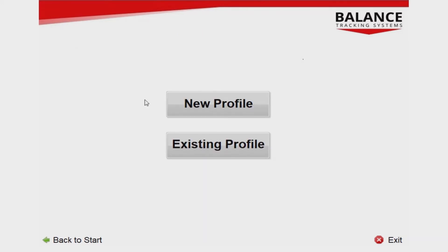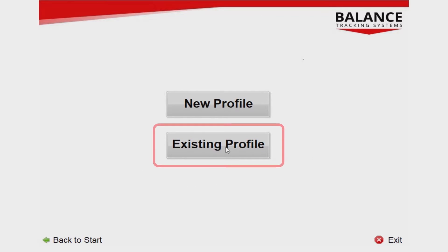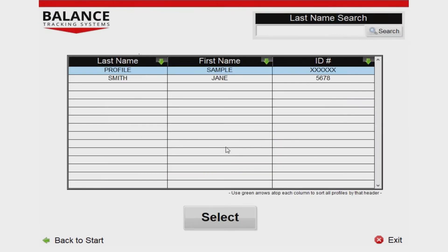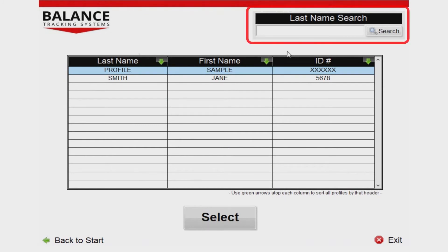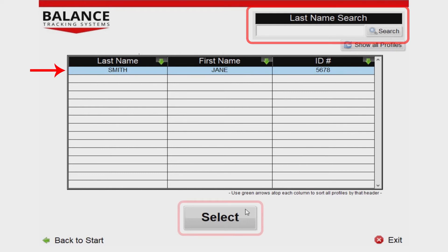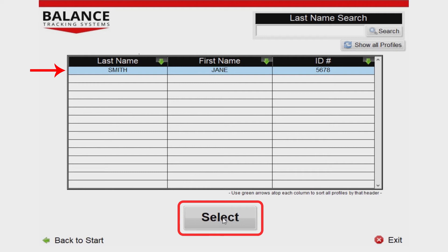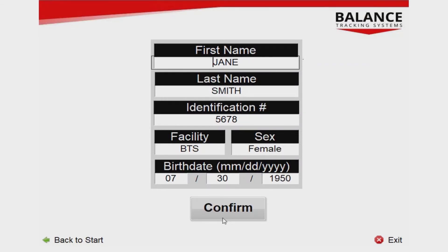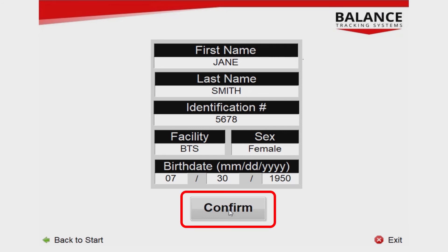Alternatively, if the person you are testing already exists in the system, press Existing Profile. This will take you to a menu where you can search and select a previously created profile. Find the person in the list and press Select when highlighted. On the next screen, make any necessary changes to the profile information, then press Confirm once everything is satisfactory.